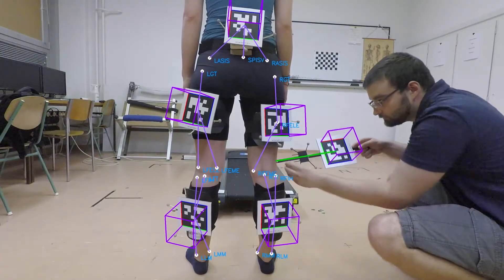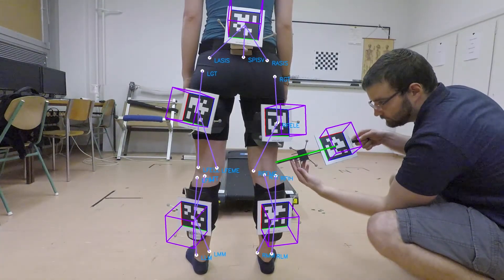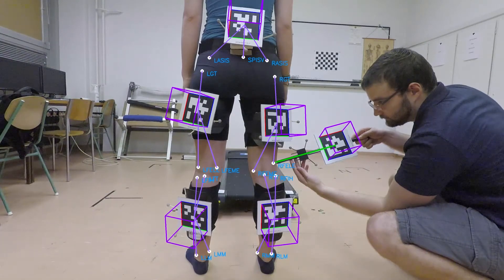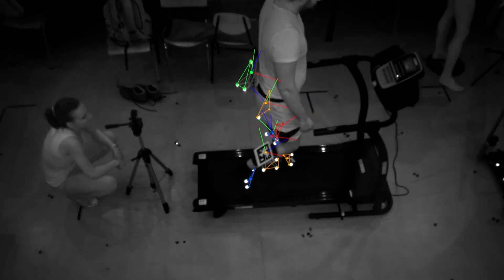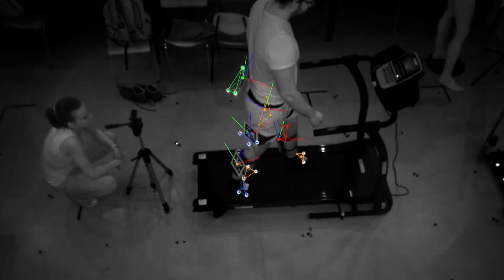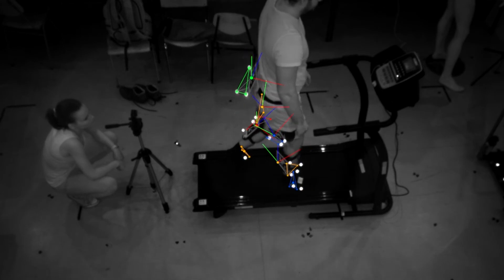Anatomical points are pre-calibrated using a pointer with a similar marker. An Opti-Track motion capture system is used to validate the measurement results.